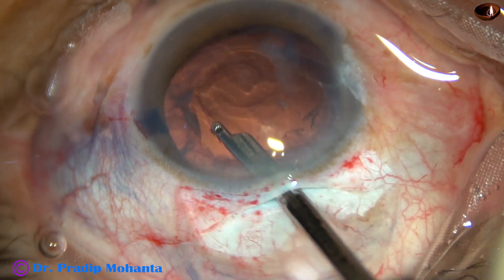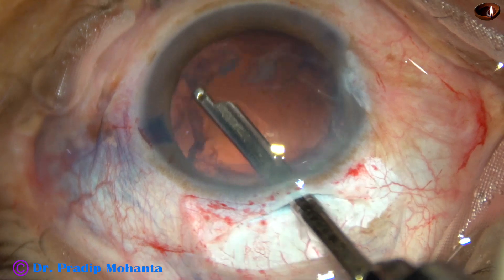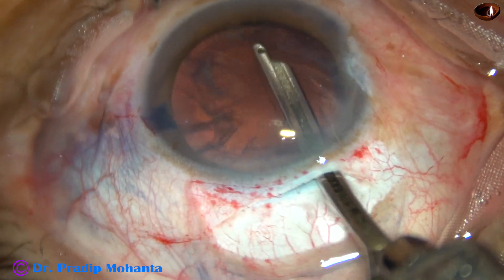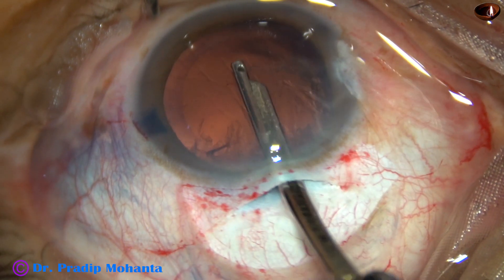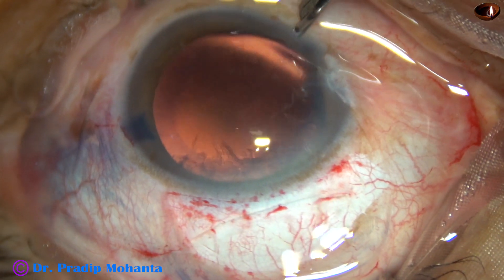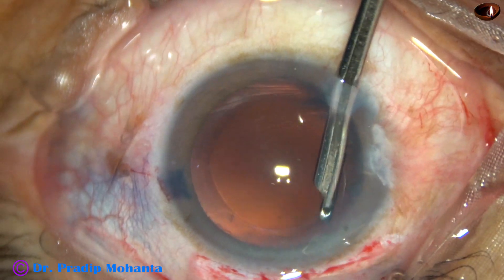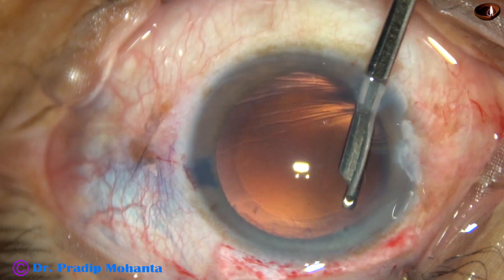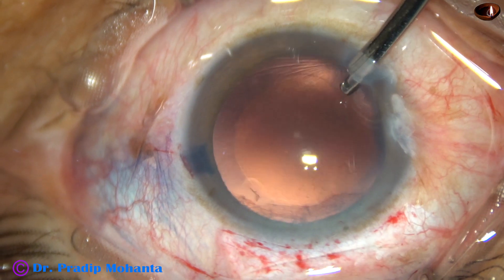This is a 23-gauge Simcoe. You can use a 22-gauge Simcoe also. It is better to avoid a 20-gauge Simcoe, which is very large. Go through the right side port and remove the cortex from the superior aspect. See how beautifully the cortex has been removed.